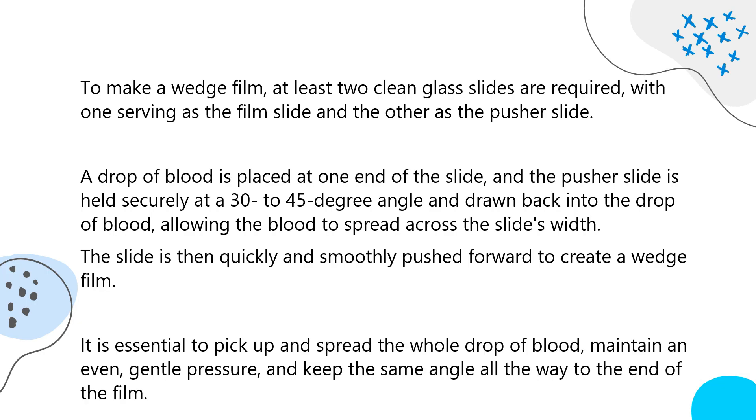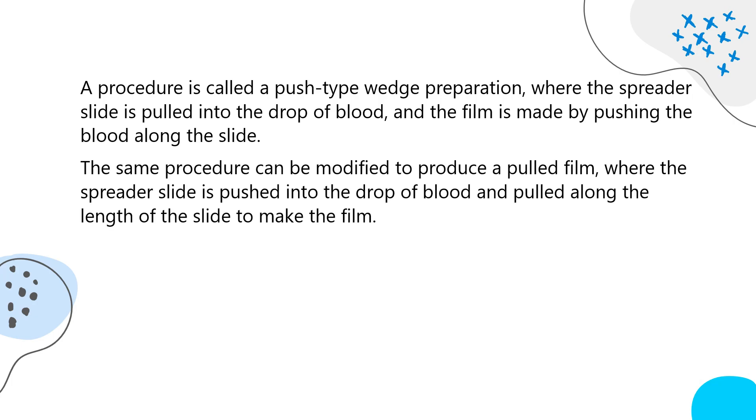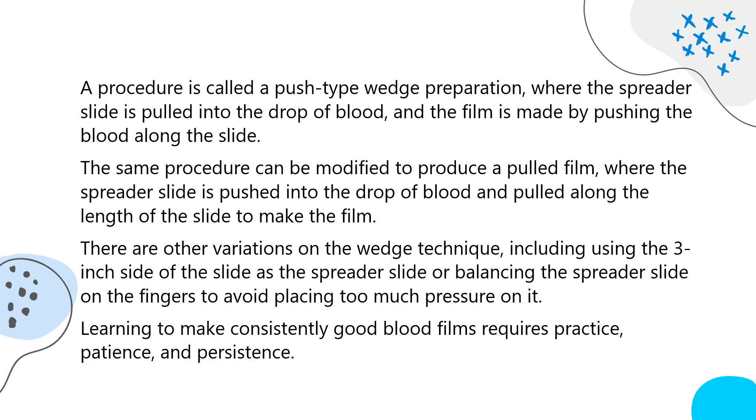It is essential to pick up and spread the whole drop of blood, maintain an even, gentle pressure, and keep the same angle all the way to the end of the film. This is called a push-type wedge preparation, where the spreader slide is pulled into the drop of blood and the film is made by pushing the blood along the slide. The same procedure can be modified to produce a pulled film, where the spreader slide is pushed into the drop and pulled along the slide. Other variations include using the three-inch side of the slide as the spreader or balancing the spreader on the fingers to avoid excess pressure. Learning to make consistently good blood films requires practice, patience, and persistence.